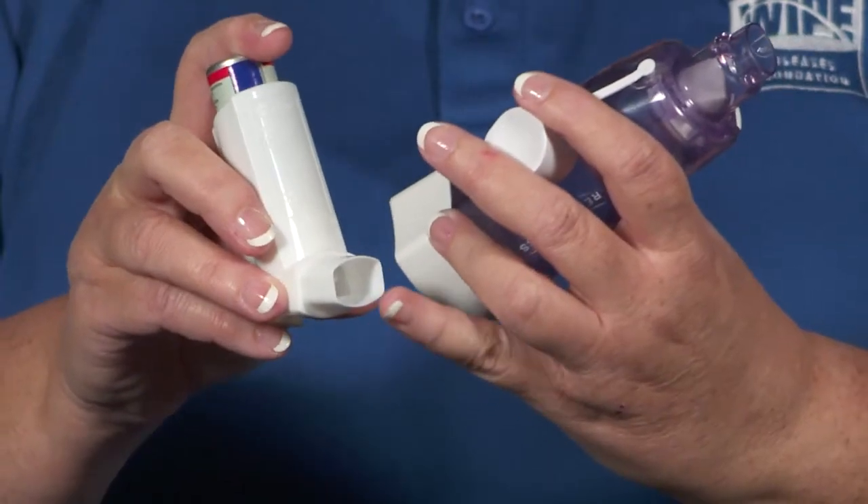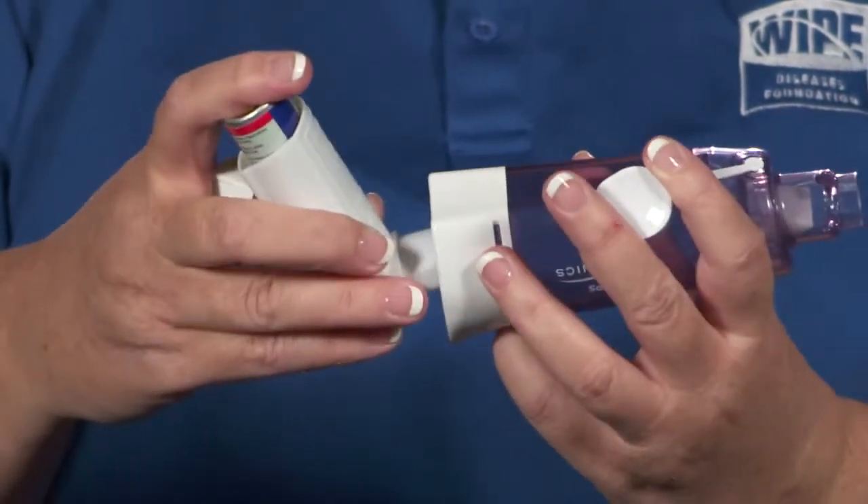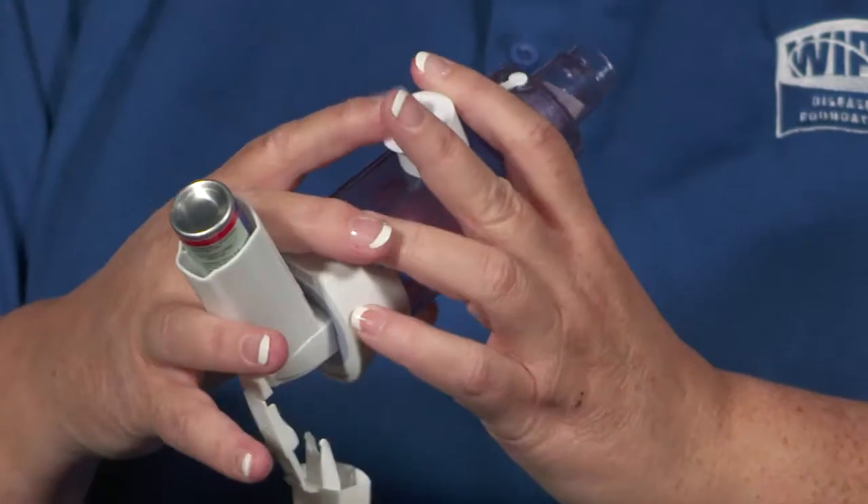Position the MDI upright and place the mouthpiece of the MDI into the rubber sealed end of the chamber. Exhale completely away from the device. Then place the mouthpiece of the valve holding chamber in your mouth between your lips and teeth and make a tight seal with your lips.